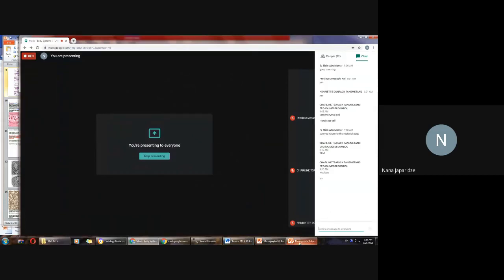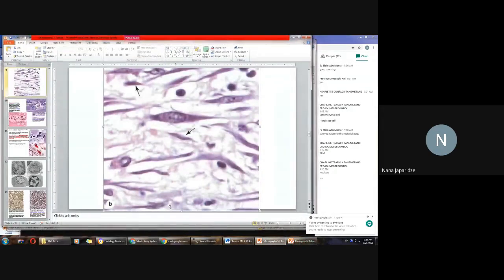So this is connective tissue. Connective tissue proper. What are these cells? Look here, dark stained. Nuclei. This, for example, might be a lymphocyte. This too. Oh, sorry, here are two cells. Look, one and another one. And a lot of collagen fibers.